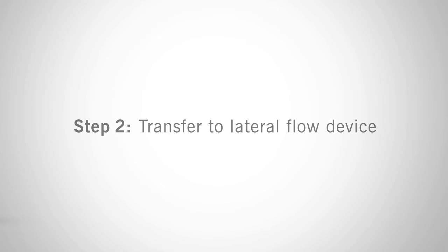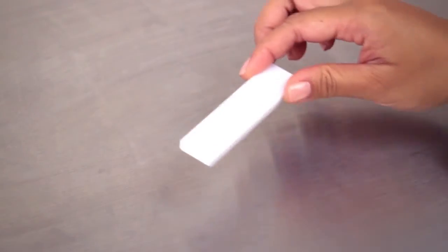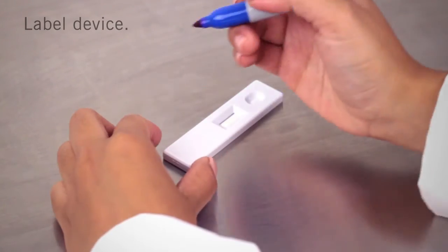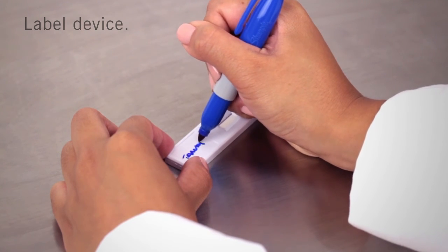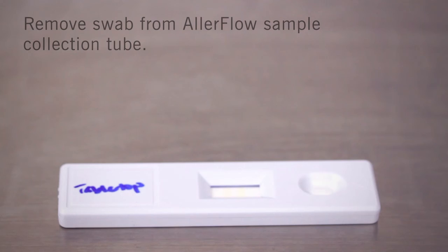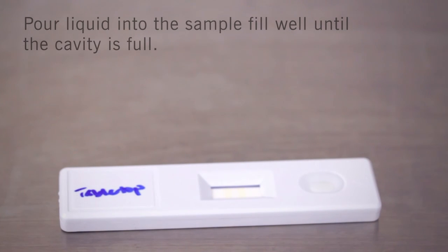The second step is transferring to the lateral flow device. Remove the lateral flow cassette from the foil pouch and place it on a flat surface. Write the location on the cassette using a permanent marker. Remove the swab from the tube, then carefully tip the tube over and pour the liquid into the sample fill well on the cassette until the cavity is full.